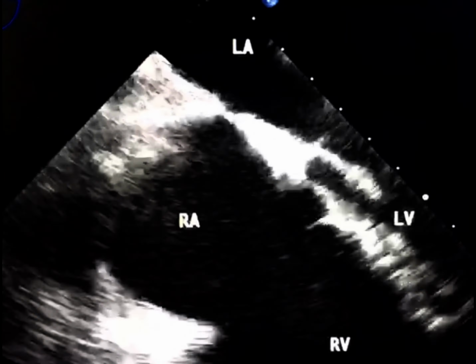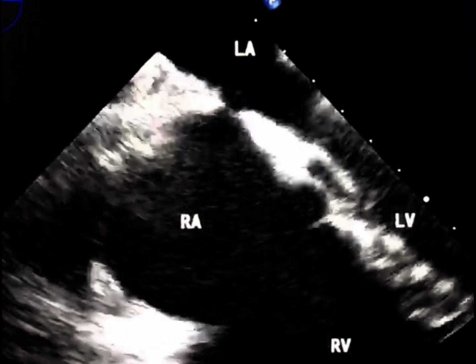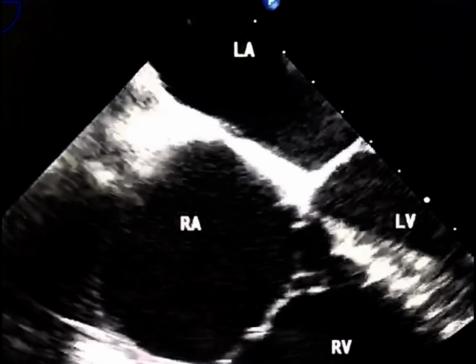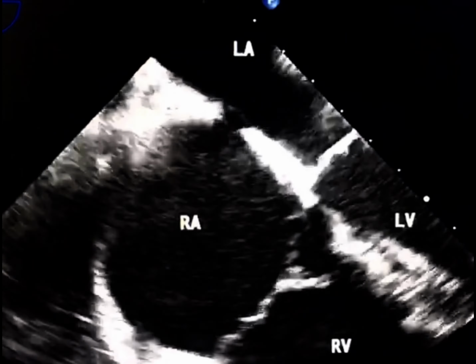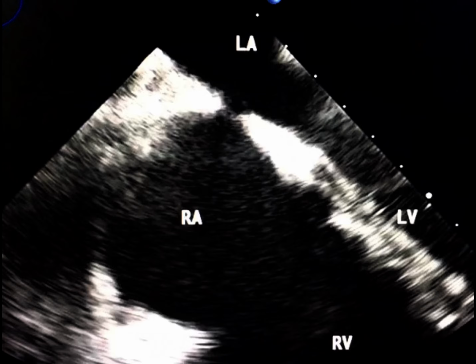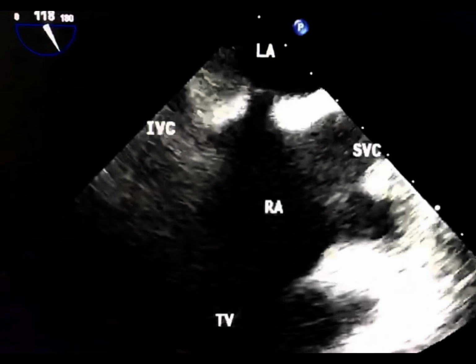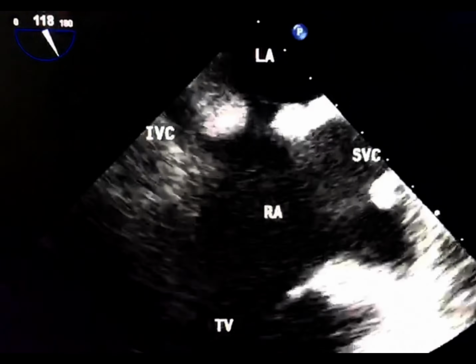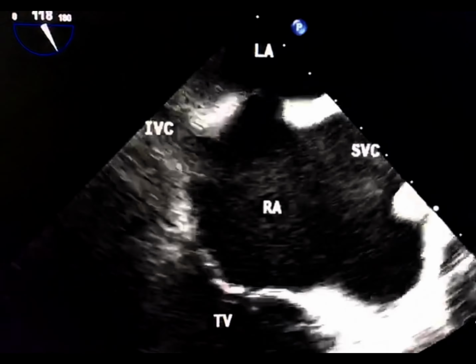Let's dive into the transesophageal echocardiographic views. The interatrial septum appears intact in this view, although the septum in the middle side is quite thin. The bicaval view also indicates an intact septum, but is this enough to rule out any shunts?